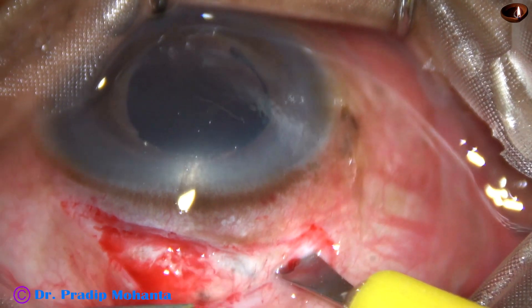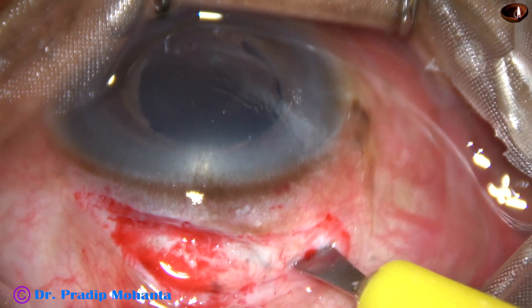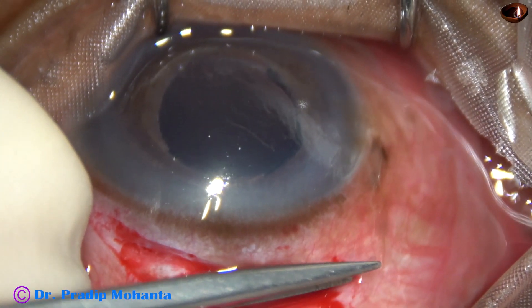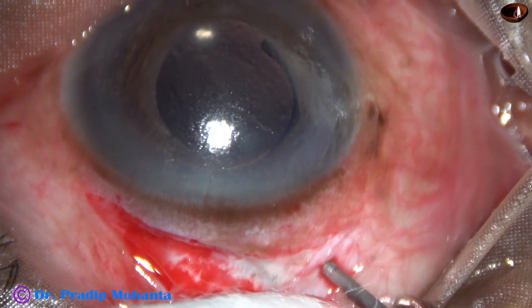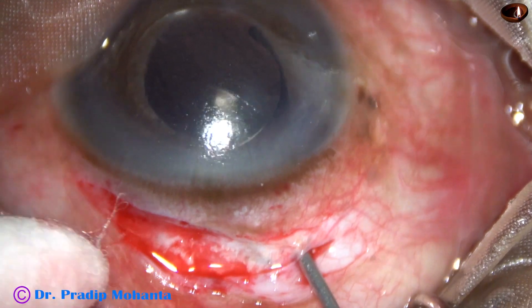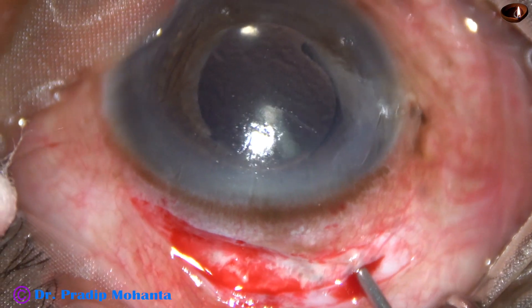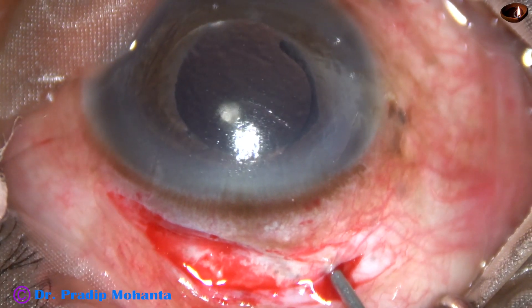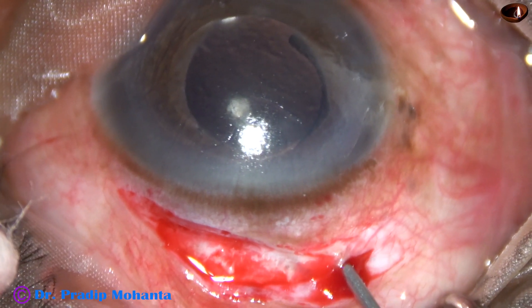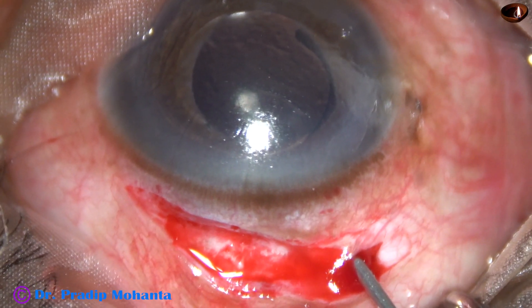The anterior chamber is flat. So without removing some vitreous, I cannot form the anterior chamber. Sclerotomy has been done. And now I introduce a 23-gauge vitrectomy cutter to do a mild amount of vitrectomy. Then I stop for some time to see if expulsive choroidal hemorrhage starts or not.